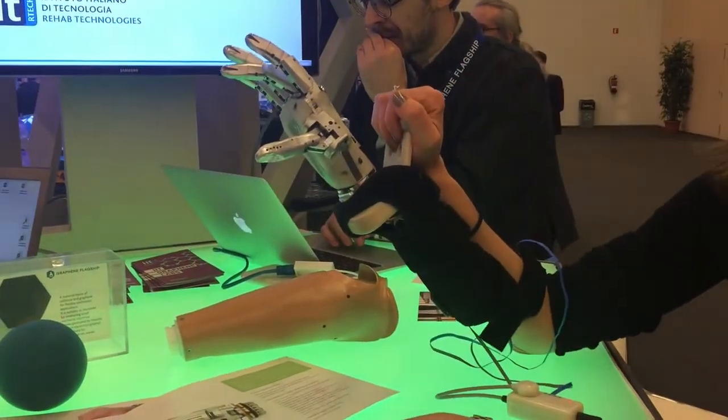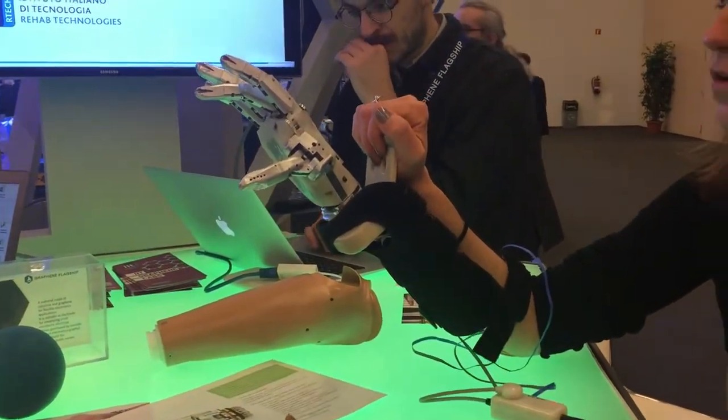So we have a low-cost sensor, a lightweight sensor, and wearable.